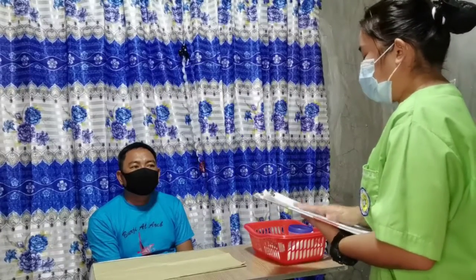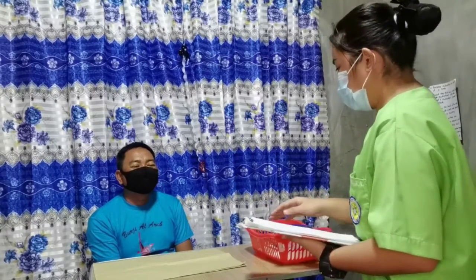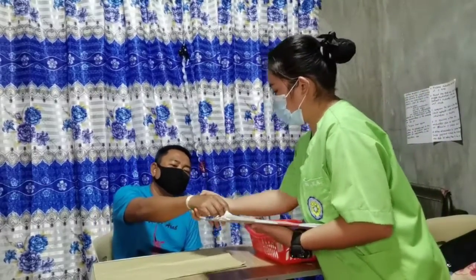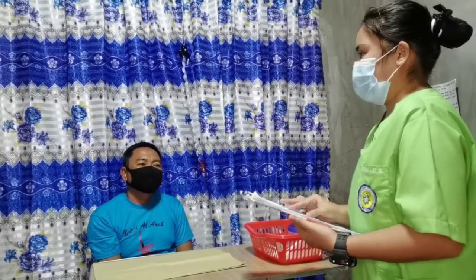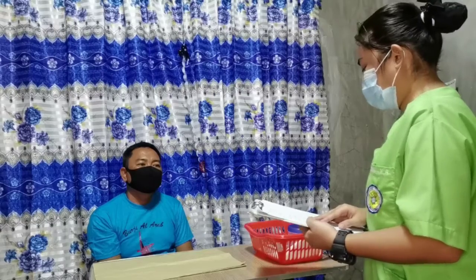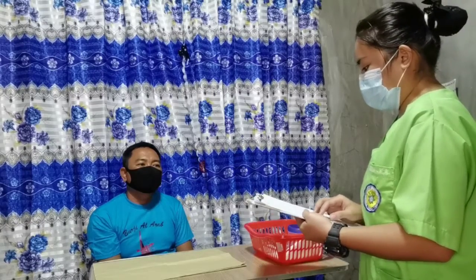Identify the patient. Usually, the patient should be identified by checking the name and identification number on the patient's identification band. Ask the patient to state his or her name. If the patient cannot identify him or herself, verify the patient's identification with a staff member who knows the patient, for the second source. Close the door to the room or pull the bedside curtain.